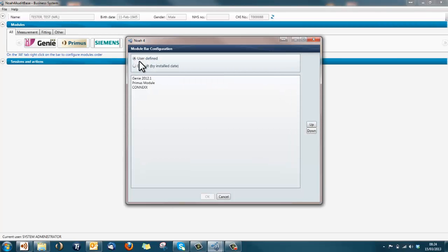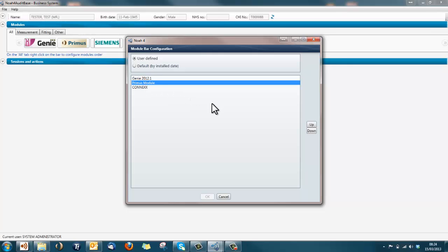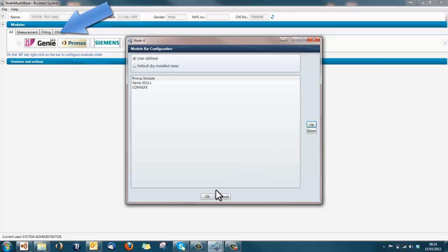You will see that there are selectable options: user-defined and default. Under this is a list of the installed modules. Select a module that you wish to move, use the up and down buttons to place the module in your desired position, and click OK.